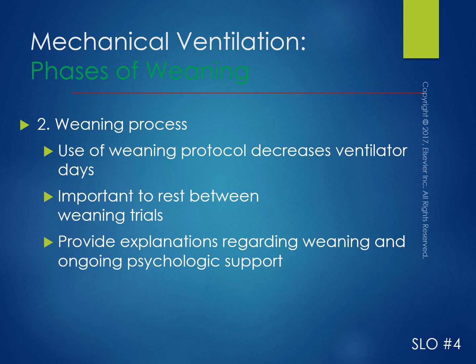Okay, so it's important that patients are assessed for weaning. It's typically done minimally daily, sometimes multiple times a day. So let's say your patient does a weaning trial at 8 o'clock in the morning, and we'll say that they fail it, they're put back on the ventilator. If they start looking good, they might try that again around maybe noon that day or 11 o'clock in the morning. So it is important to rest the patient between the weaning trials, meaning that we have the sedatives back on, the ventilator providing full support, and then try again later on.